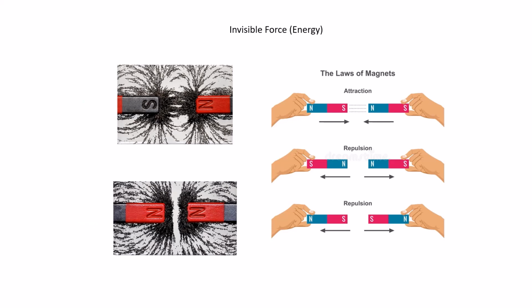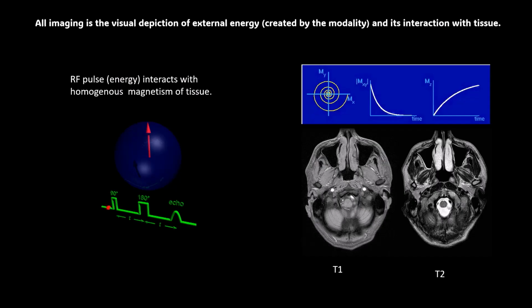Let's see what happens when we actually use a radio frequency pulse to disturb this invisible force, whether it is attraction or repulsion.